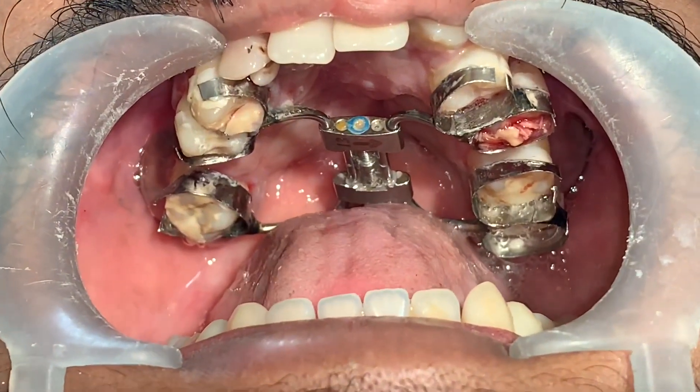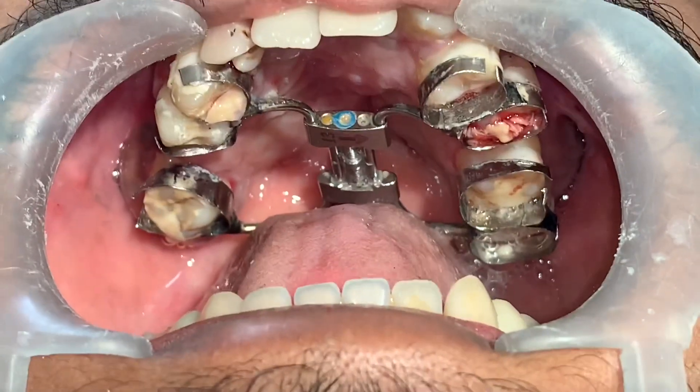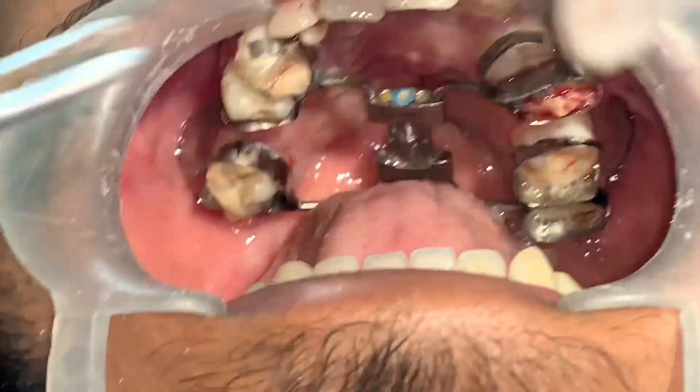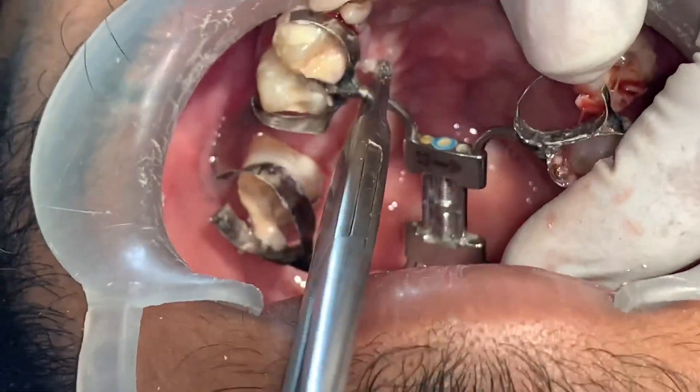This is a distractor that we use in this patient to create new bone. Now the job of the distractor is done, so we are going to take it off. The dentist has already made the cuts and now this is the last step when we are going to pull it out.